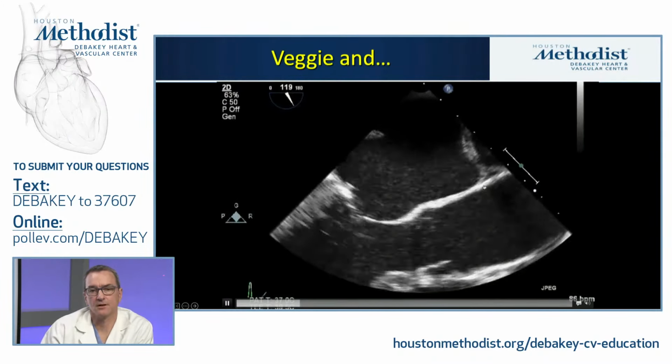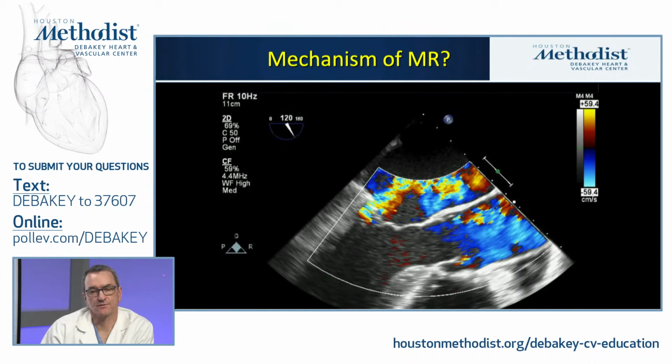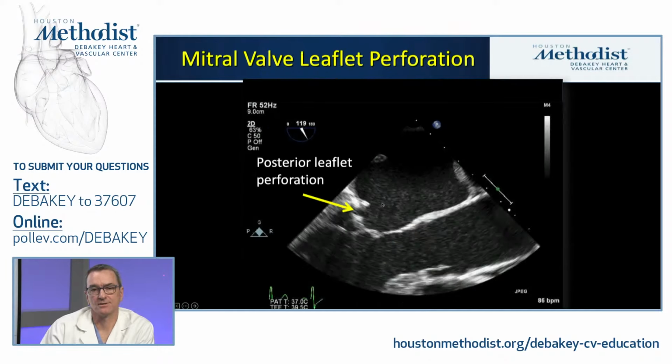When we turn on the color Doppler, we see there's flow right there, and now MR by itself is not all that surprising sometimes, but if you look very closely, you see that the origin of the MR is not at the leaflet coaptation at all. This is where MR generally would occur, where anterior meets posterior leaflet in this 3-chamber view, but in fact we have a little wiggling motion, and we have a perforation at the base of the posterior leaflet. So that's a very telltale sign of endocarditis. It's exceedingly rare to have a spontaneous leaflet perforation without infection.